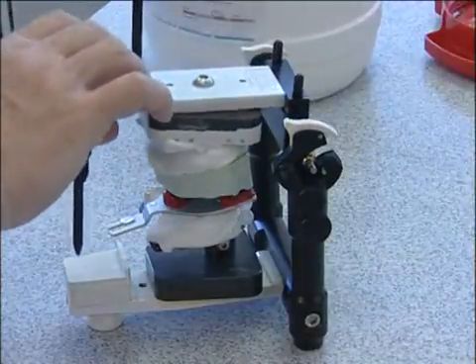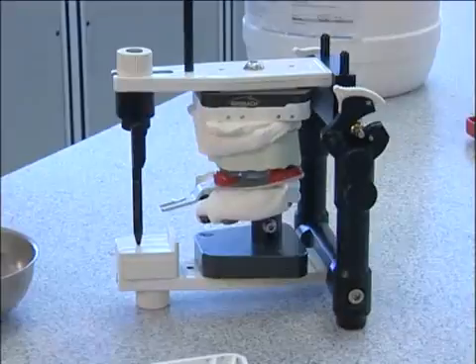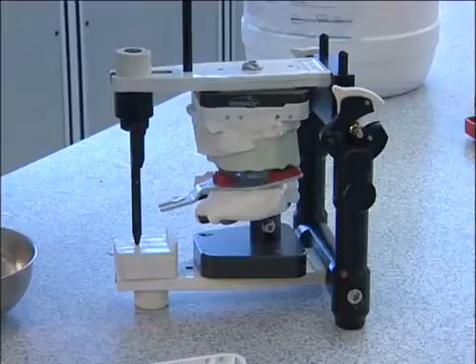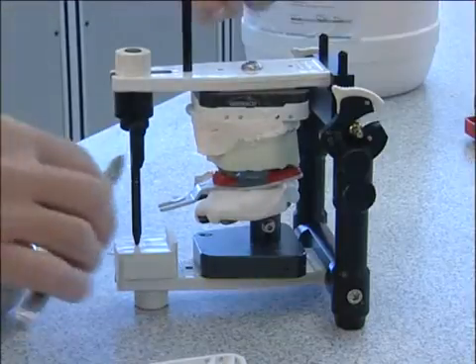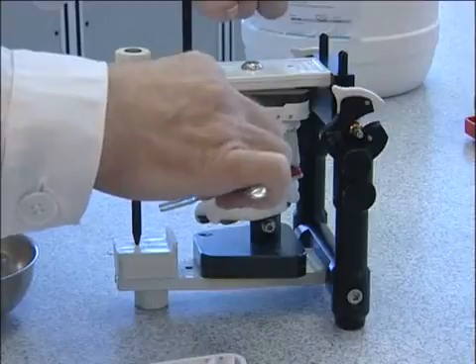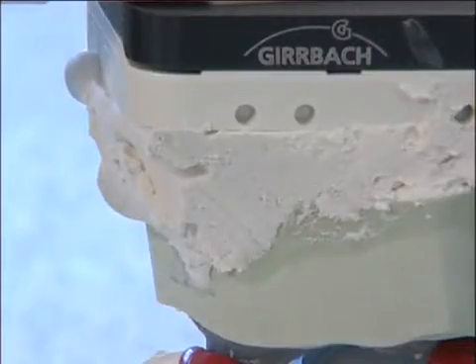The articulator is closed and the tension in the plaster slurry released by tapping the top of the articulator with your fingers. The incisal guidance pin now contacts the incisal table, but without exerting pressure. During the first 3 minutes of the setting process, the excess plaster can be wiped off effortlessly. Once the plaster has set for approximately 4 minutes, the articulator can be opened.